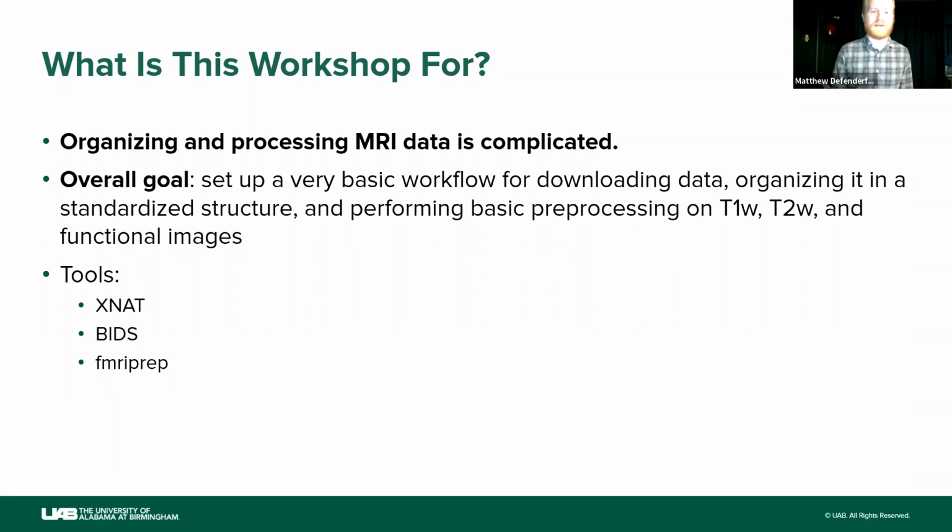People who have done that know that it can take upwards of 20 to 30 minutes if the Osiris computer is not in use. And it can take longer if you're waiting on people to use that computer and get off so that you can use it. So Xnat is a very useful tool because after the session is complete, you can just send those scans up to Xnat and leave, and they will be available to you anywhere that you have internet access. Like I said, everybody at UAB has access to it.